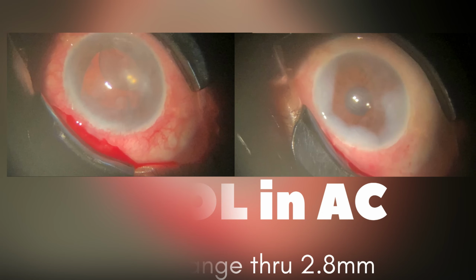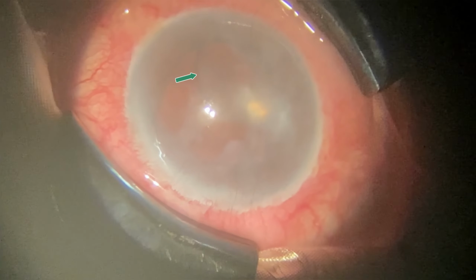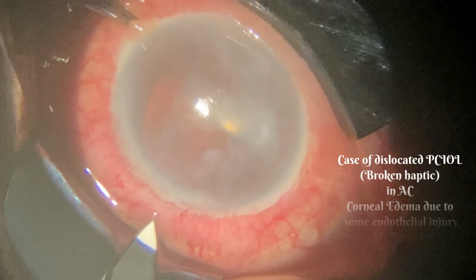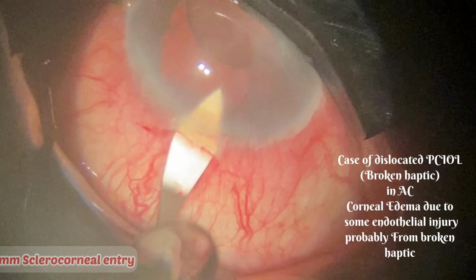Hello friends, today's interesting case is PCIOL in anterior chamber, IOL exchange through a 2.8 mm incision. This is a case of dislocated PCIOL in the anterior chamber due to broken haptics, and corneal edema due to some endothelium injury, probably due to the broken haptics.